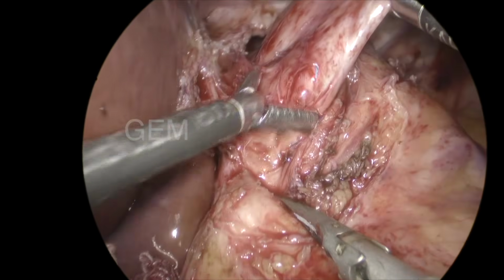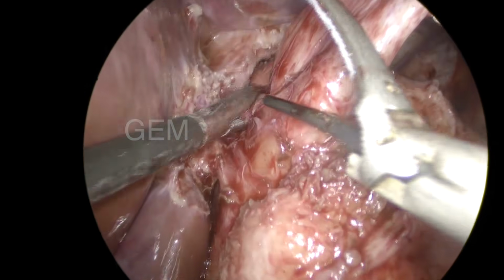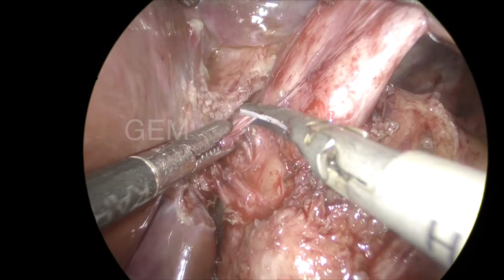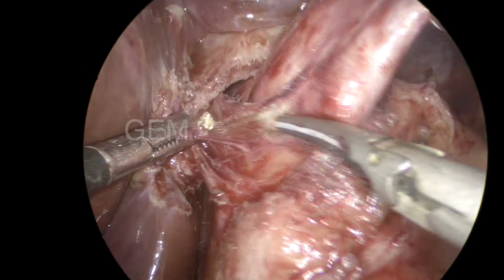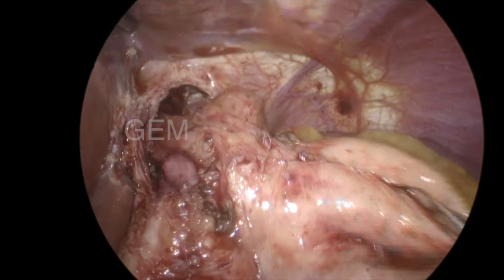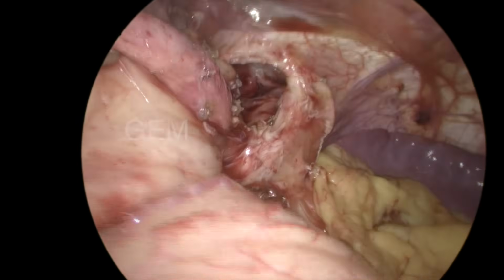So when you are doing any redo surgery, you have to be very careful. You have to dissect very patiently. Identify the structure. Meticulous dissection is required. And this should be a definitive surgery. The patient should not have any problem after this surgery. You have to keep that in mind.